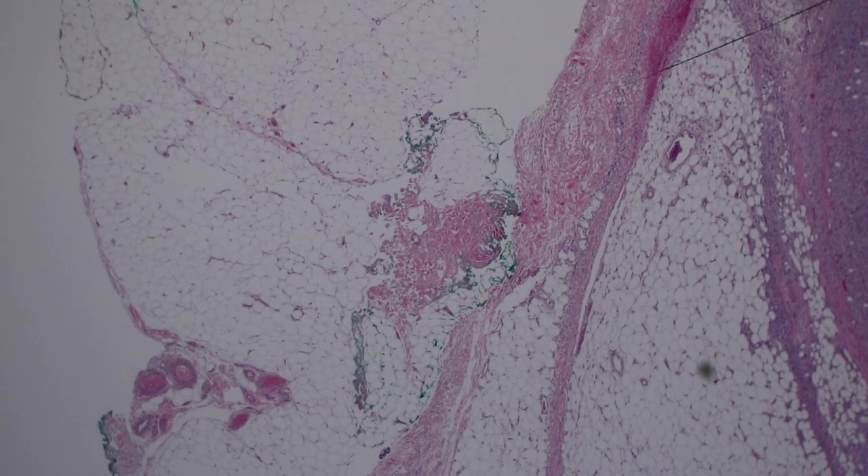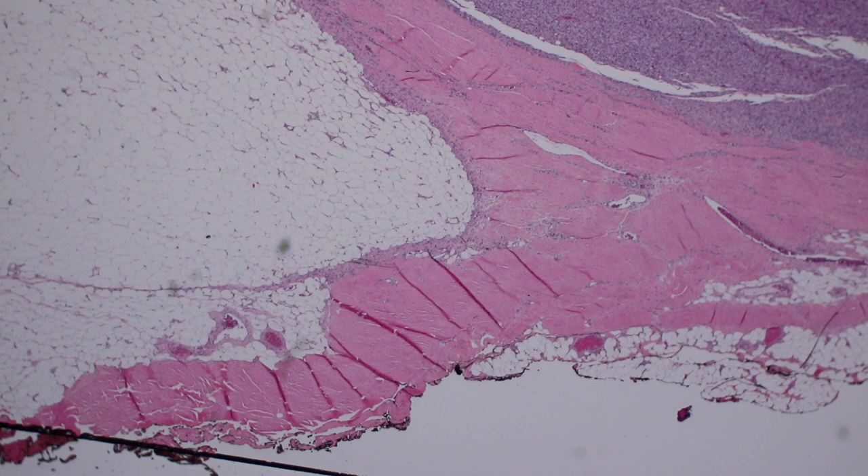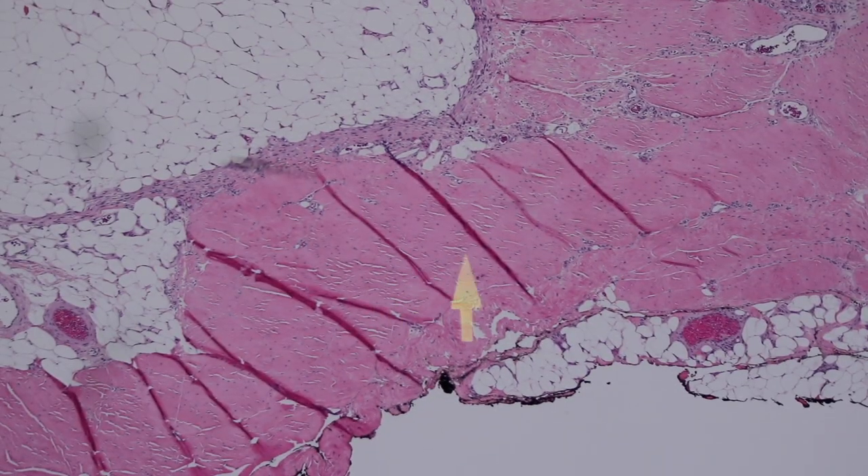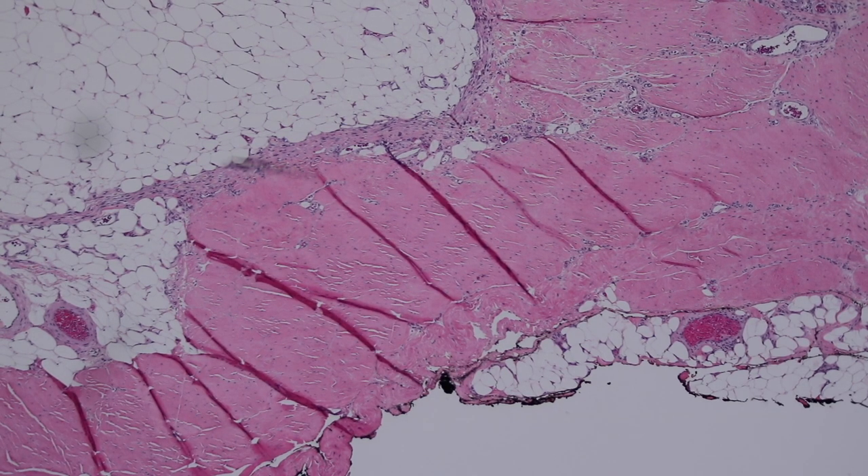One last structure to cover: this is subcutaneous fat. In the fat here is a very large tumor — a sarcoma — but we won't talk about that in this video. The reason I'm showing this is that at the very bottom of the fat, where the subcutis meets the muscle underneath, you have a thick layer of pink material. This is dense regular connective tissue — dense collagen. This is called fascia. Tendon, fascia, and ligament all look more or less identical microscopically; it depends on where exactly it's located. Those dark stripes are artifact from folding when the tissue was cut — sometimes tissue doesn't lay out perfectly flat.